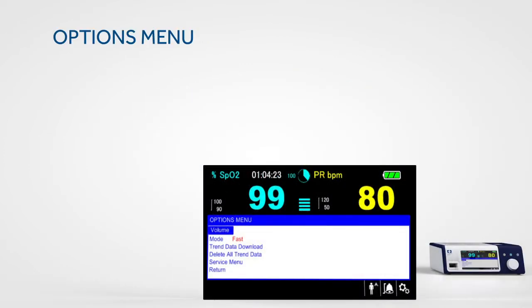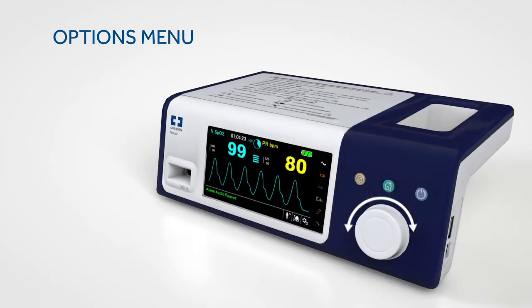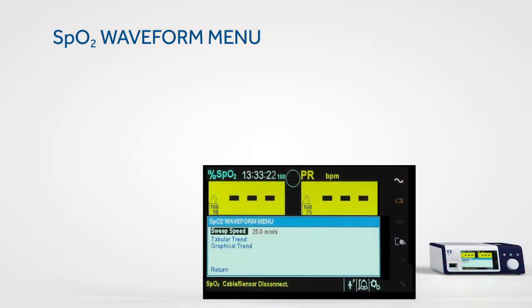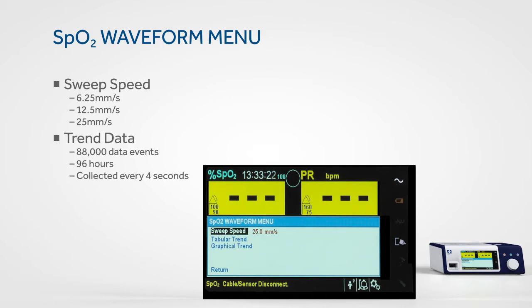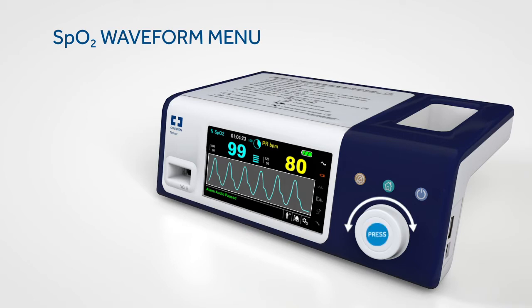The options menu provides access to settings for volume adjustments, response modes, and other settings. To access this menu, rotate the jog dial to highlight the options icon and press. The monitoring system also allows you to set the sweep speed of the waveform and opt to view the tabular or graphical trend screen. To access one of these functions, simply rotate the jog dial to highlight the waveform or trend display area and press.